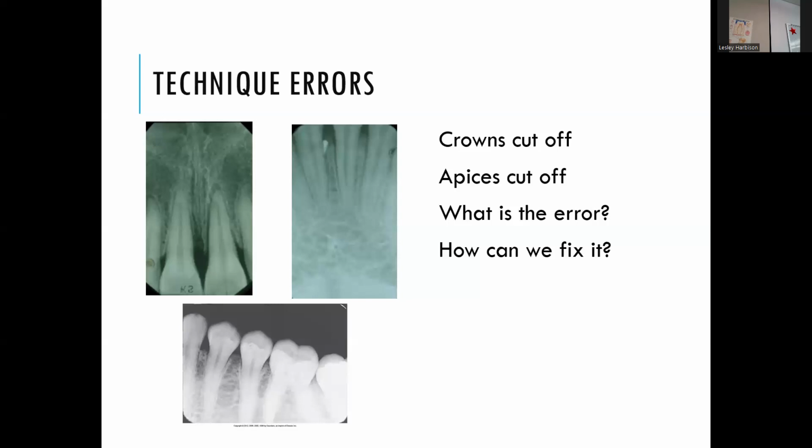There are some images, yes. And I think they all are around errors in placement. Placement is one of the errors. So yes, there are some images, and you'll have to pick them. Sometimes the patient just moves it. Yes, and that can happen.